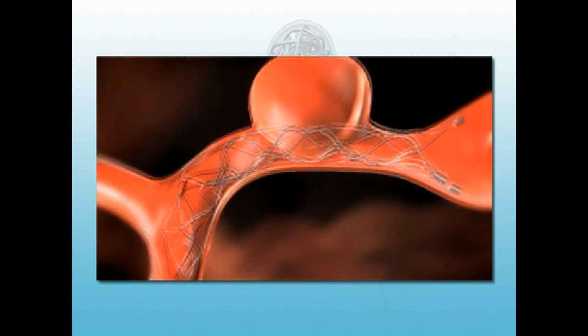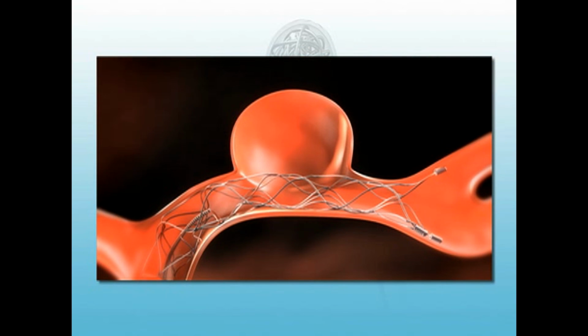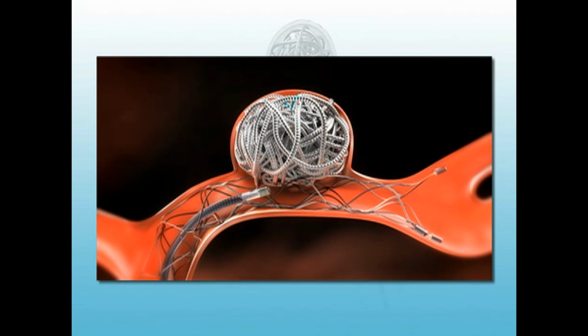When performing the technique of placing embolic coils into the aneurysm through the interstices of the Solitaire AB, use a microcatheter with a distal tip of less than or equal to 2.5 French. Perform a standard embolic coiling procedure using accepted embolic coiling practices.